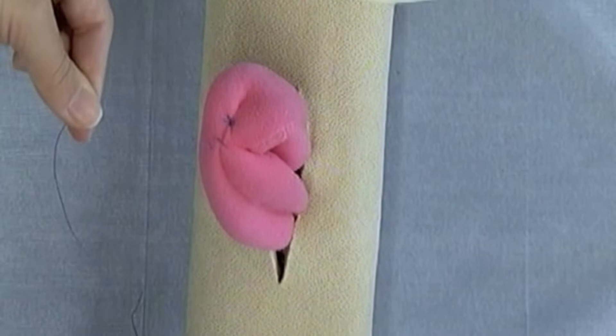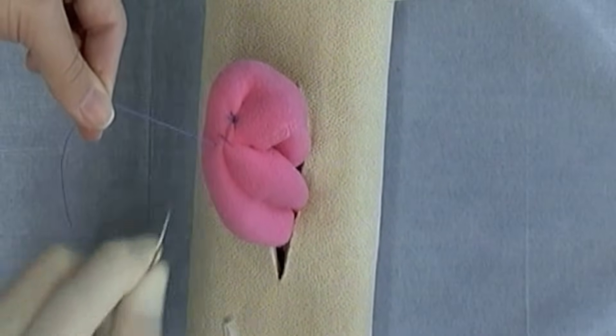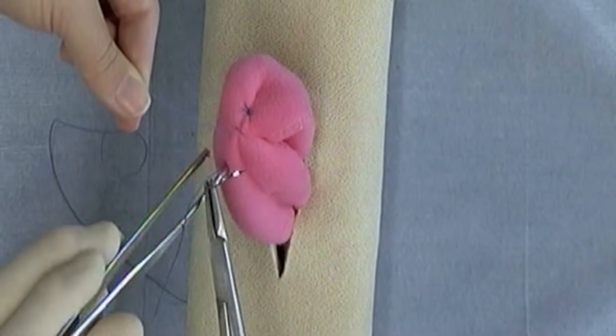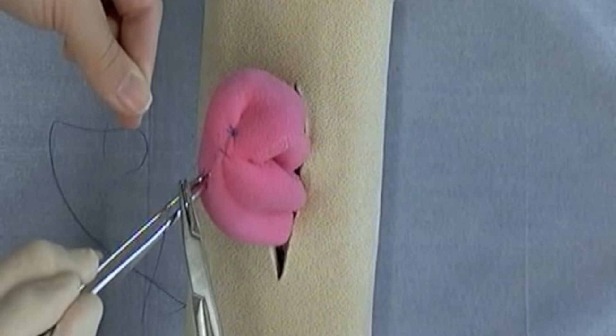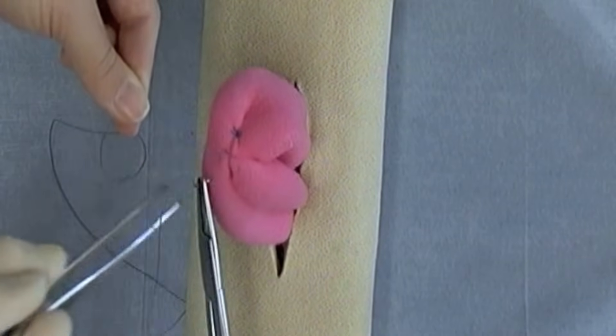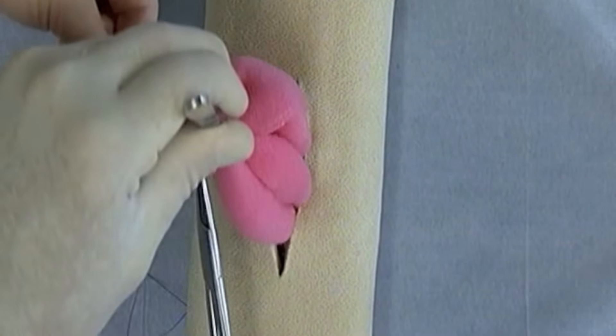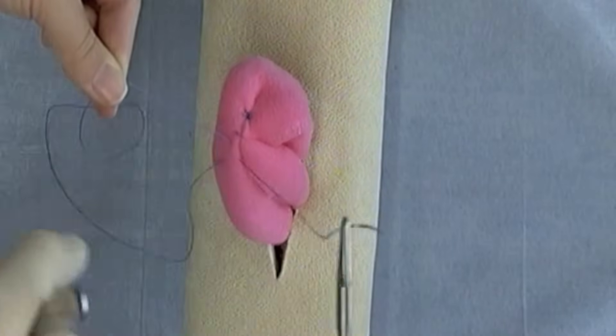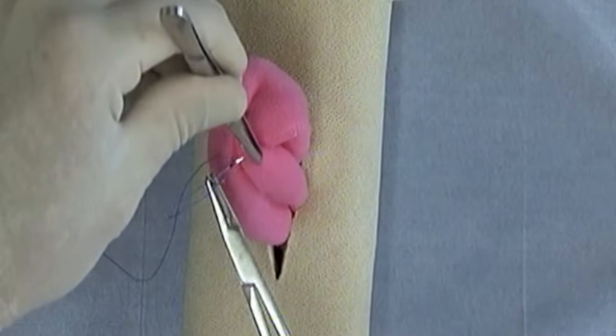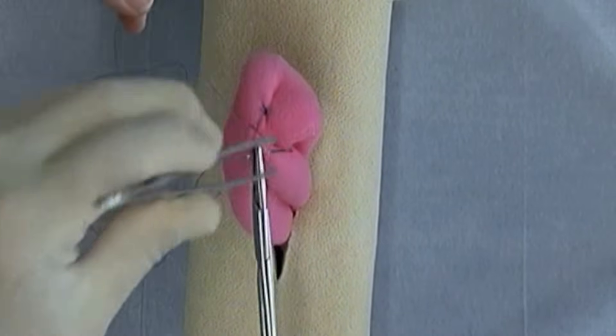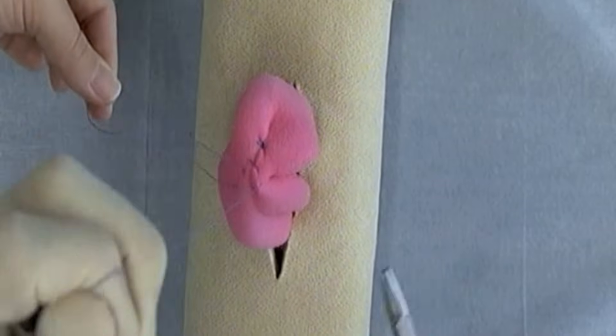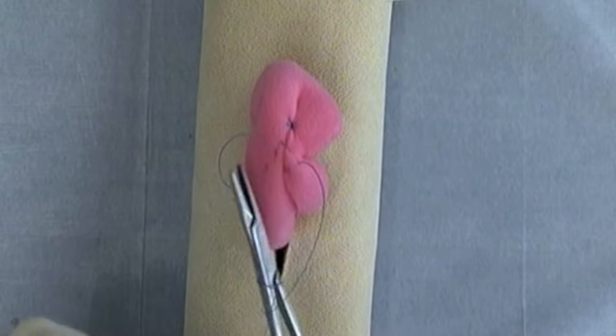And then to end this pattern I'm going to reverse and I'm going to in backhanded fashion take my final Lembert suture bite on each side, or my final bite on each side, and then tie back to the loop.